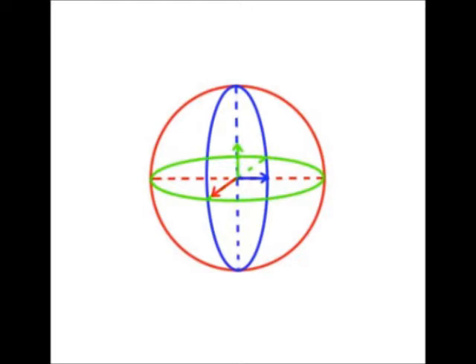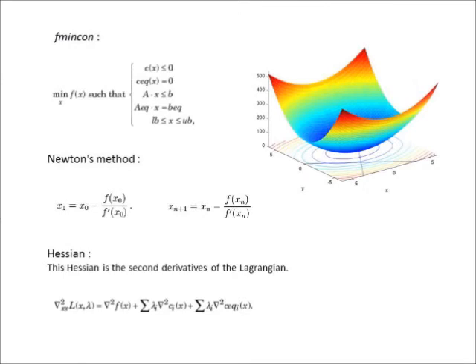While we are trying to find the XYZ coordinates of the sensor inside this system, we are also trying to find its orientation. The orientation consists of 3 normal unit vectors, all of which are perpendicular to each other. So therefore, with 2 unit normal vectors, we can find the third one using a cross product. fmincon has 4 algorithm options: interior point, SQP, active set, and trust region reflective. The interior point and SQP algorithms were suitable for our type of problem.